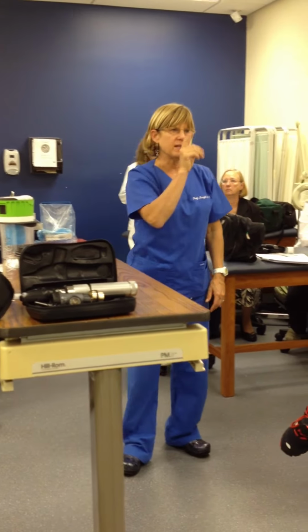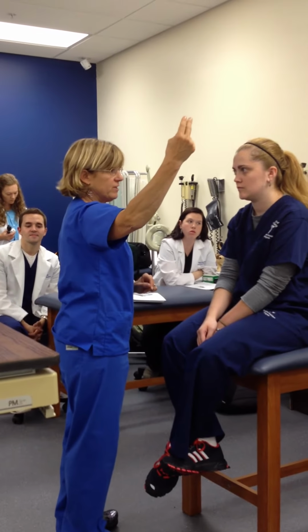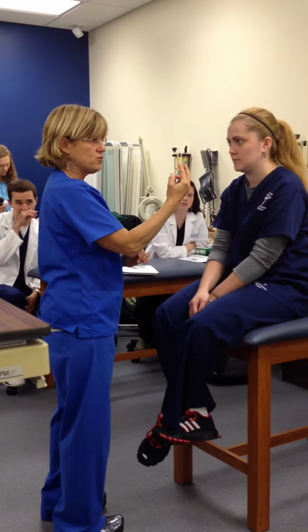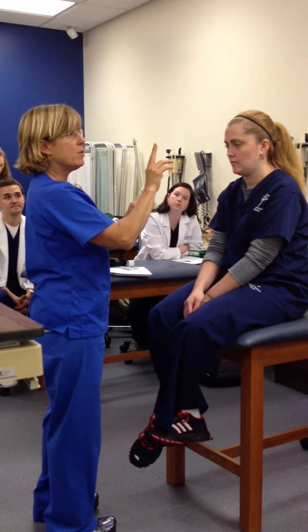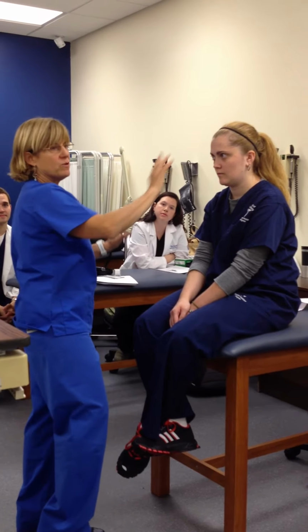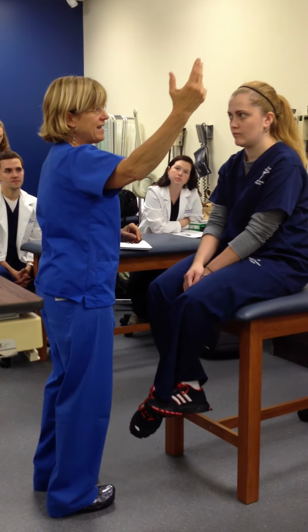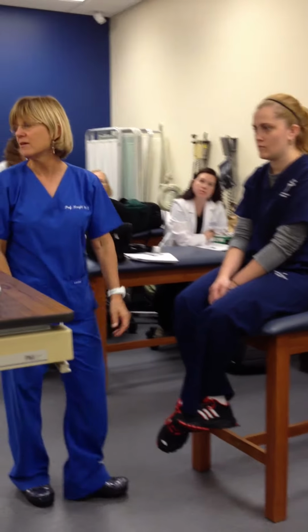One of the things that, like, if the patient had macular degeneration, they might be fine peripherally. That's why you say, tell me when you can no longer see them, so that if you come across in central vision, and they go, oh, I can't see them. Oh, yeah, now I can see them again. So that would be, or they get real blurry in the central vision, something like that. So that's why I kind of wiggle them. You don't have to.